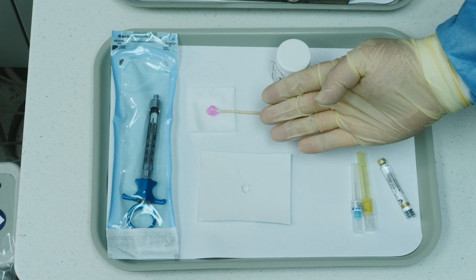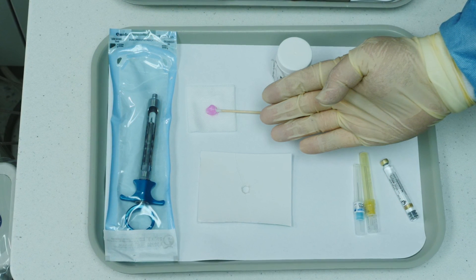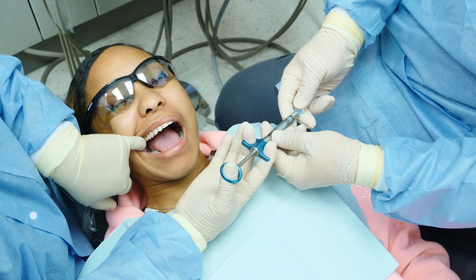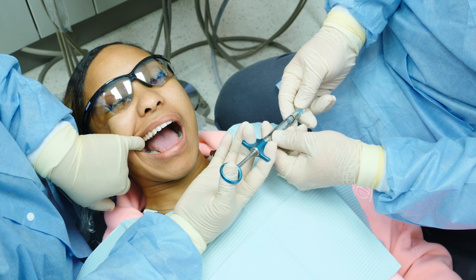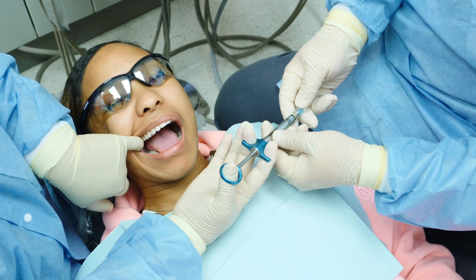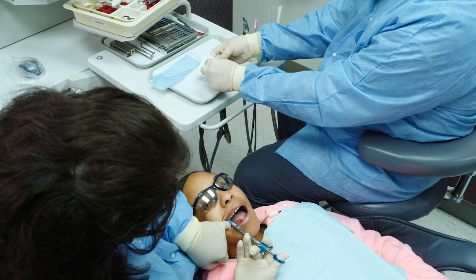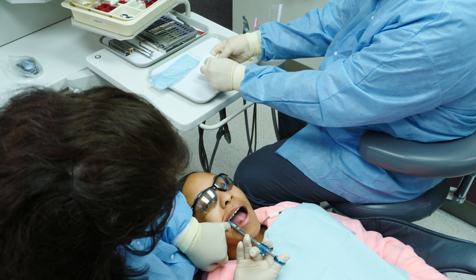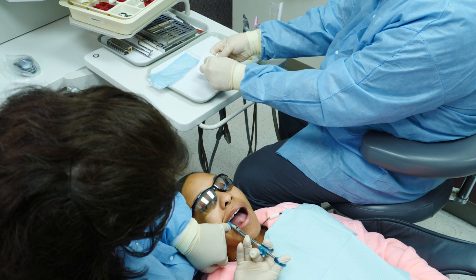The most commonly used methods of pain control are local anesthetic agents. Local anesthetic agents help to safely manage pain by injecting an anesthetic solution near the nerve close to the planned treatment area. The numbing effects last long enough to complete most dental procedures while leaving the tissue in its original condition once the patient has recovered.